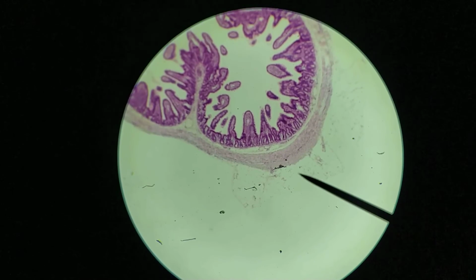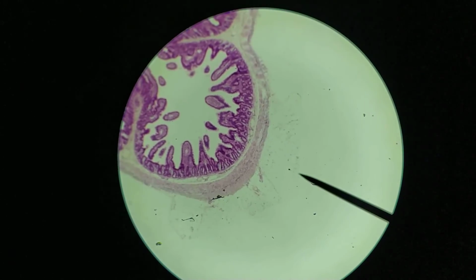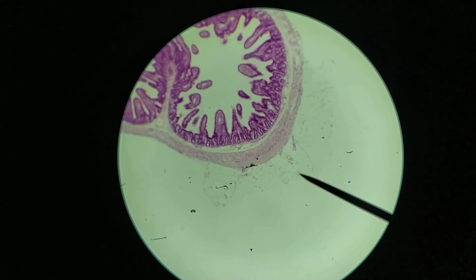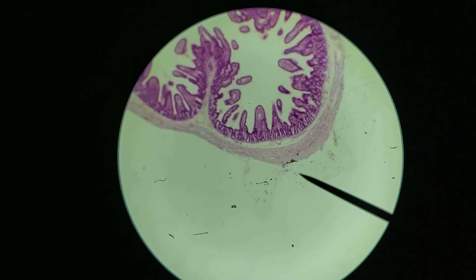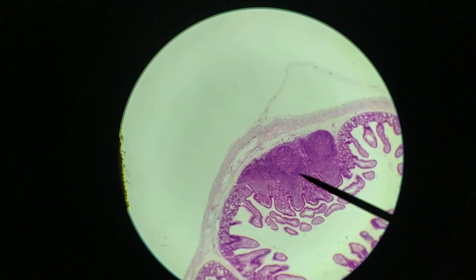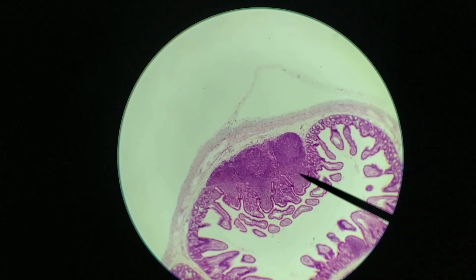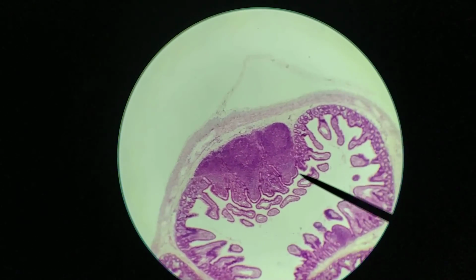This is called the mesentery, and this is attached to other parts of the rest of the small intestine as well, and so it's just been chopped off here, but this is the entry point of the mesentery, and so wherever you have the mesentery, on the opposite side of that is where you would expect to see a Peyer's patch, which is what you're seeing here. Okay, so again, a very typical feature of the ileum of the small intestine.